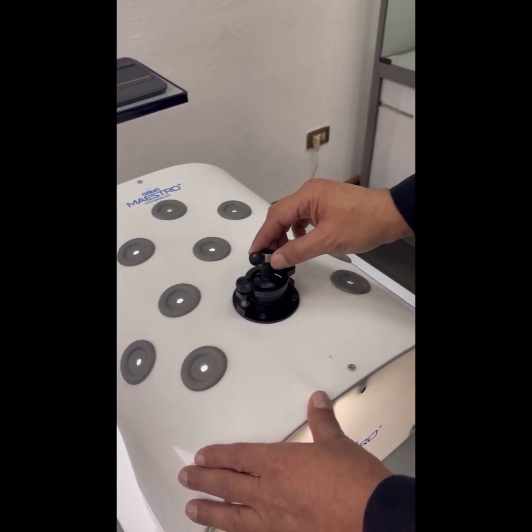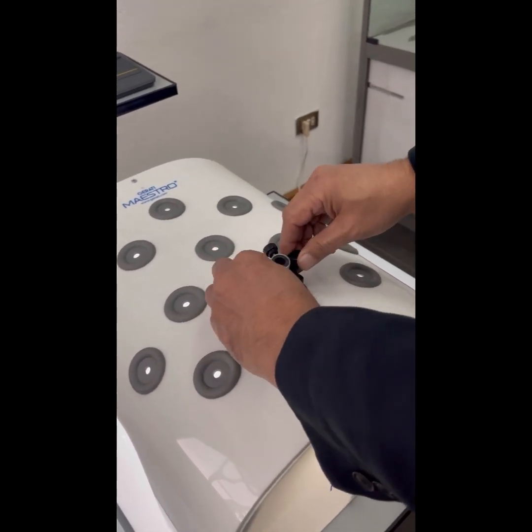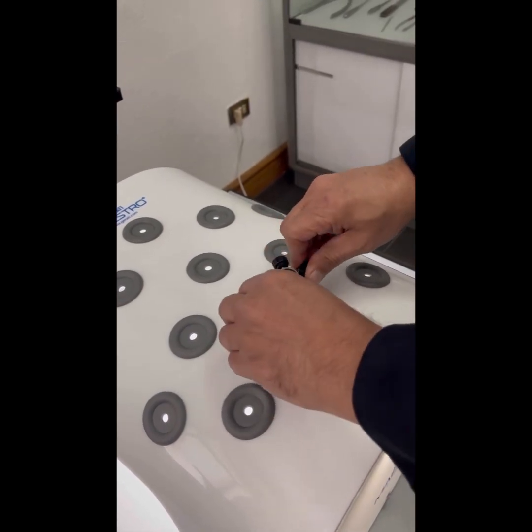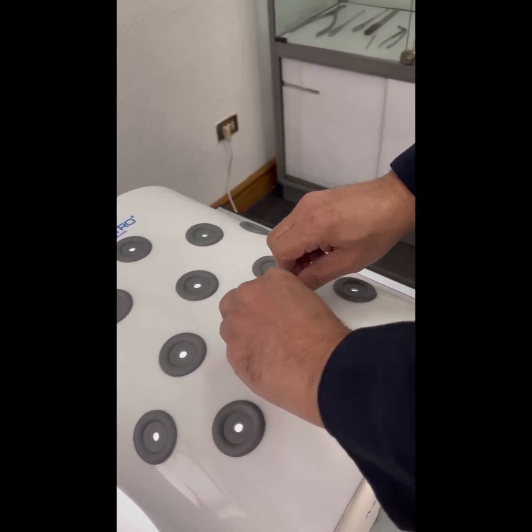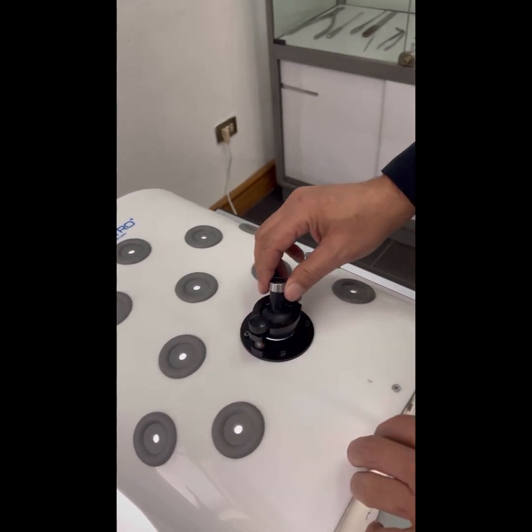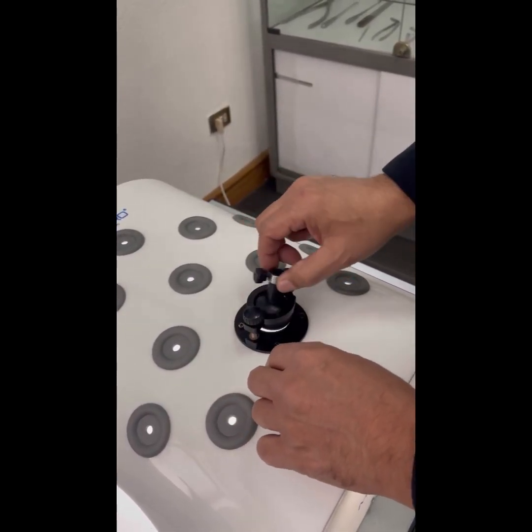If a single person is training, the camera position can be fixed by tightening these two screws. Now the camera is fixed at one particular position. For two persons, the screws can be loosened and the ball becomes free to rotate in any desired position.